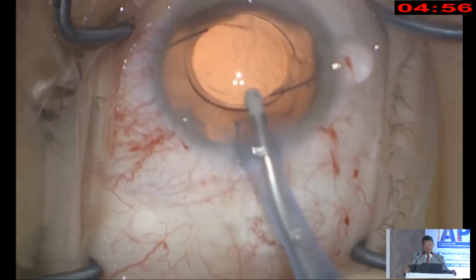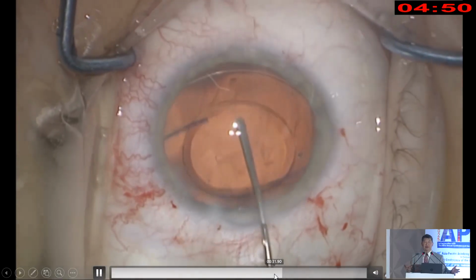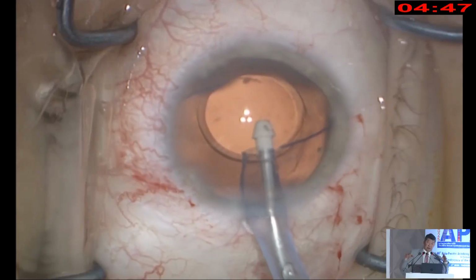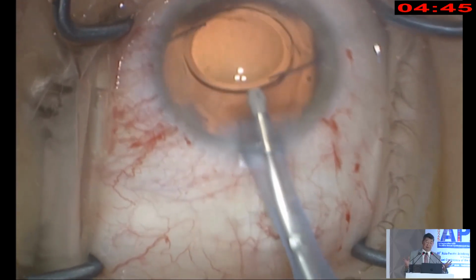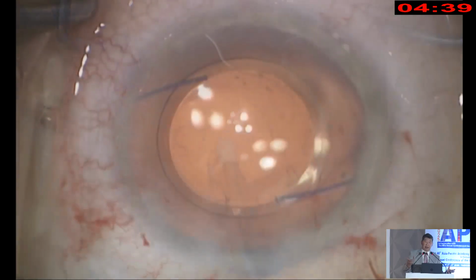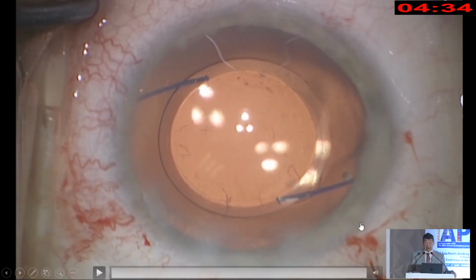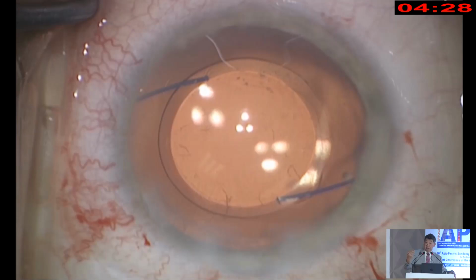And what's different here, let me just go right back to here. You know, we're used to doing this when we have an open posterior capsule. We put the lens in the sulcus, capture the optic. But it's different when you have a bag, because the viscoelastic will get caught there. So I have to vacuum out a little bit of it before I then plop the optic through there for the optic capture. Otherwise, what happens is that trapped OVD will sort of push the optic forward, and you'll get a myopic surprise. And the way you get out of that is I'd have to YAG the posterior capsule, and that would then let the OVD bleed out posteriorly.